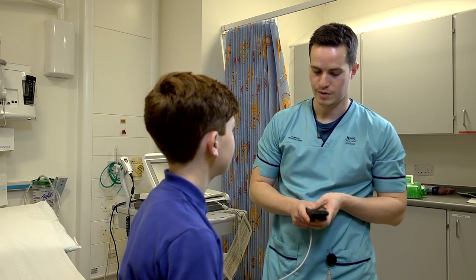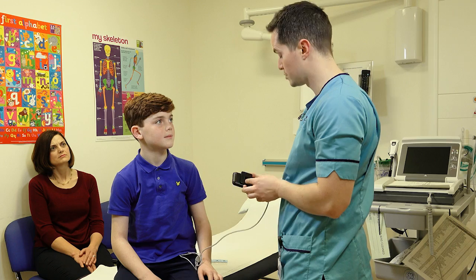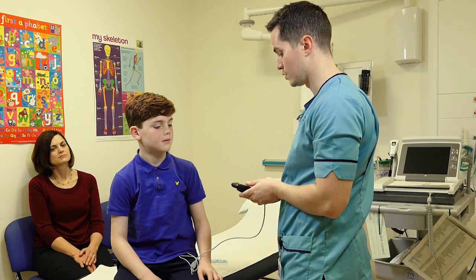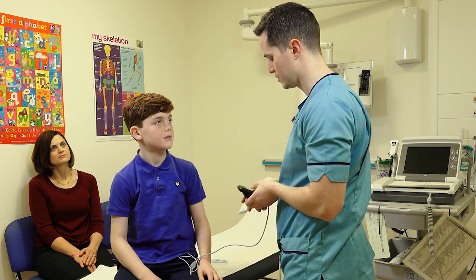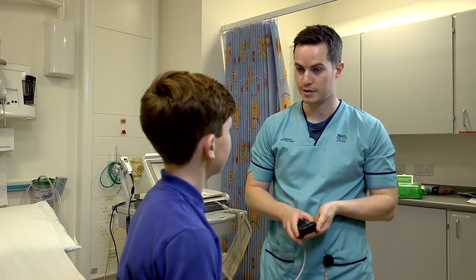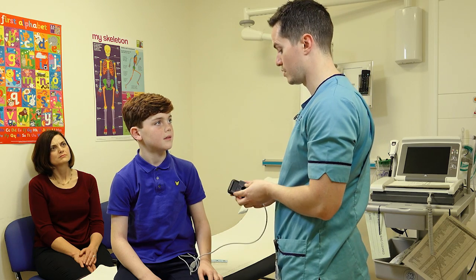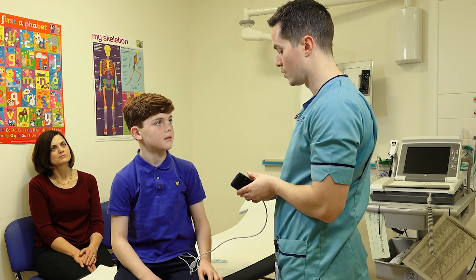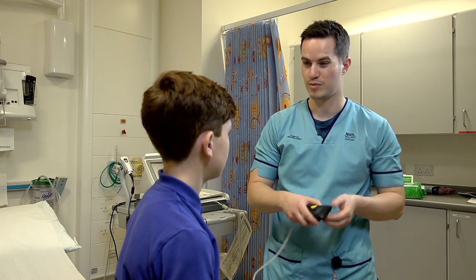In terms of how you wear it, you can really wear it wherever it's comfortable for you. It is small enough to be put in a pocket, or it's got a little clip so you can attach it onto whatever you're wearing. When you go to sleep tonight, it's probably easiest to put it in a pocket in your pyjamas, or the wire is a little bit longer so you may be able to stick it by your side or put it underneath the pillow.